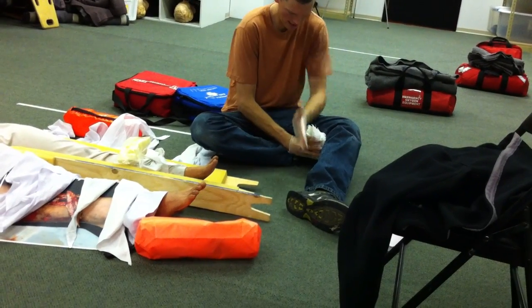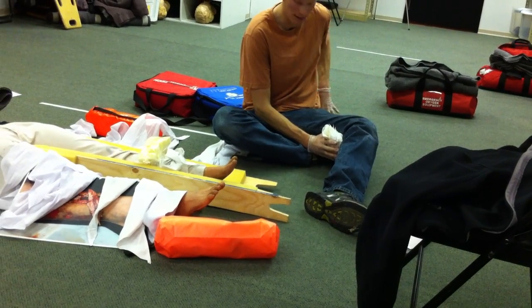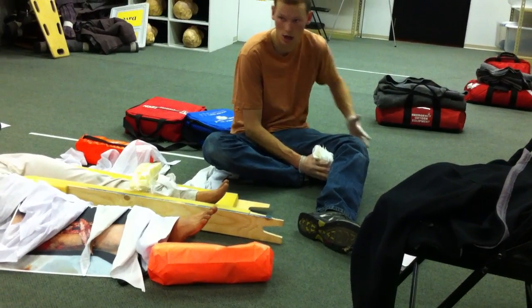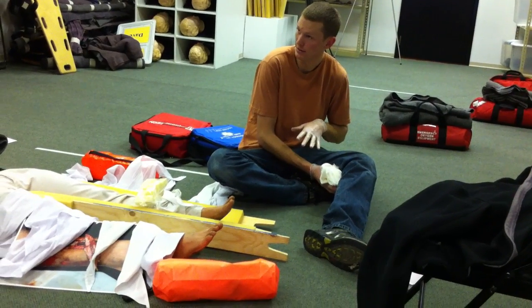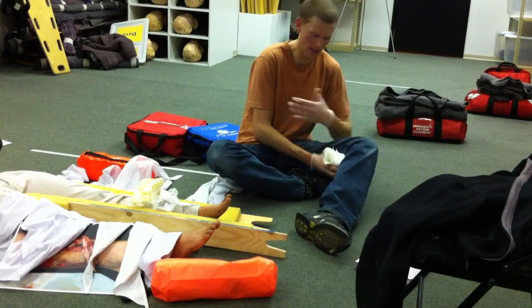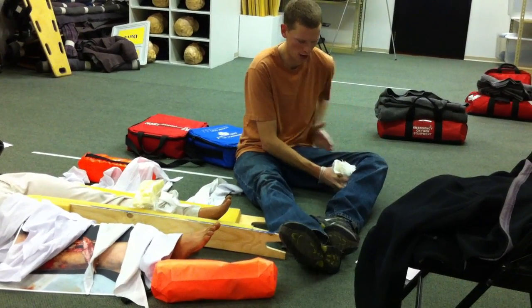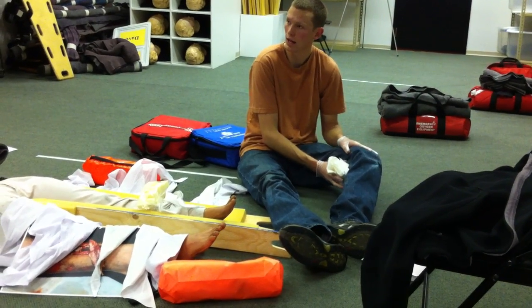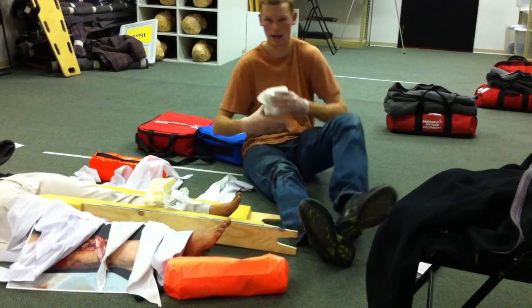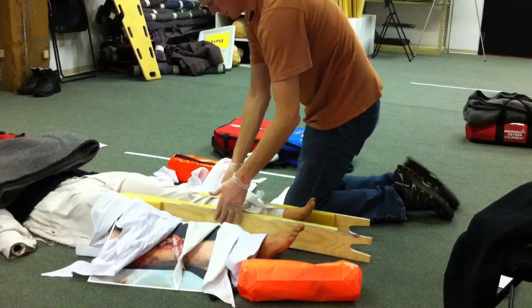So I would be packing in here so that the splint would fit, and then I would be packing here and here. So you've got a lot of packing to put in there to hold that leg in whatever position you find it. This is excessive, of course. If it was not going to fit in my basket, then we would be doing some gentle alignment to anatomical so we can get them in there. Okay, so we've got our splints in place.